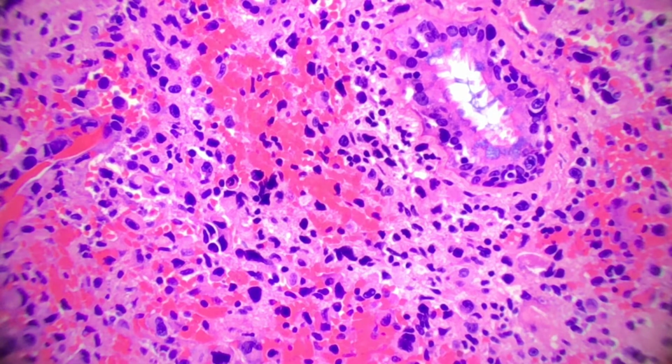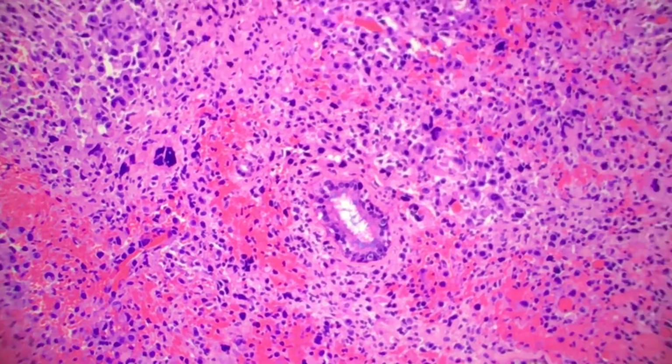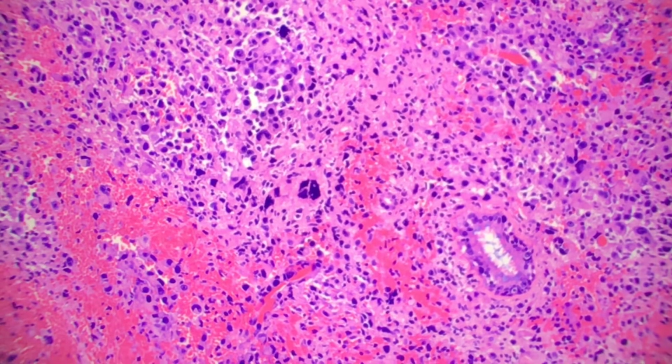So some of the cells are more spindled or fusiform, where they have tapered ends. They may or may not be a little wavy. A lot of the cells look more epithelioid, where they're maybe more polygonal. The cell borders are slightly better defined, and there tends to be moderate to abundant eosinophilic cytoplasm. The nuclei tend to be very irregular. They are very hyperchromatic. So we're not, again, really going to bank on getting those cherry red nucleoli that we would necessarily see in other melanomas.